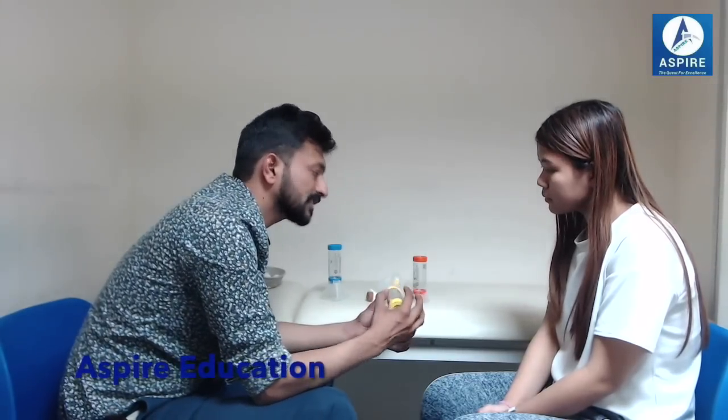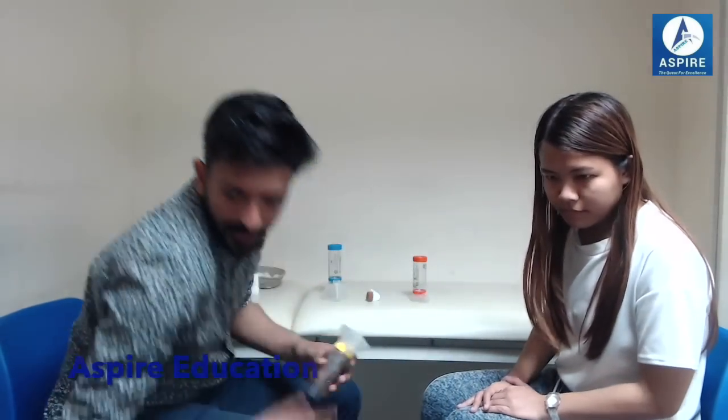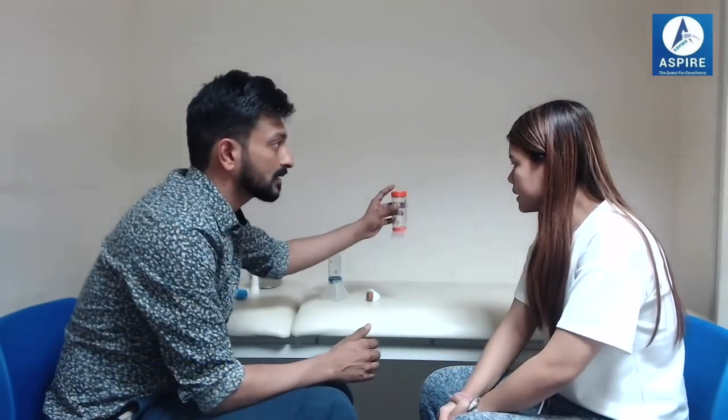If your child is going to school, make sure you tell the nurses there about your child's condition, and you can leave one spacer at school as well so the nurses or teachers can help if there's any problem. To summarise the three spacer sizes: the orange one is for 0 to 18 months, the yellow one is for 1 to 5 years, and the larger one is for more than 5 years.